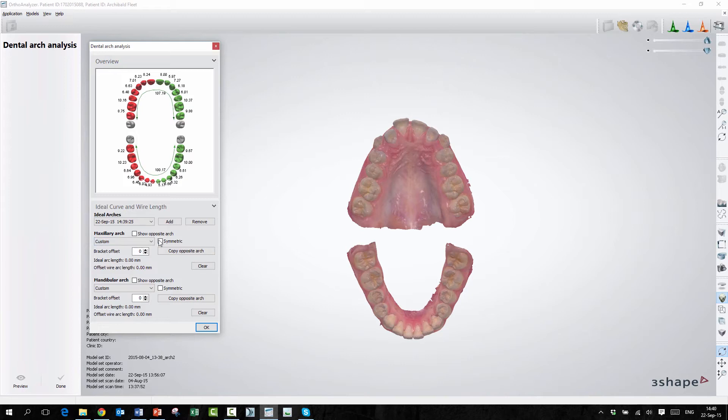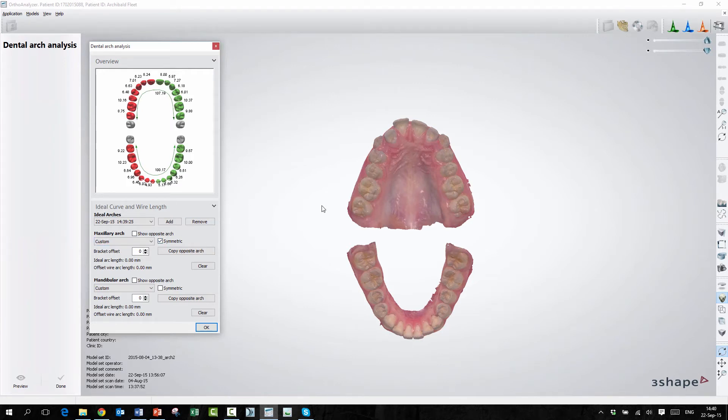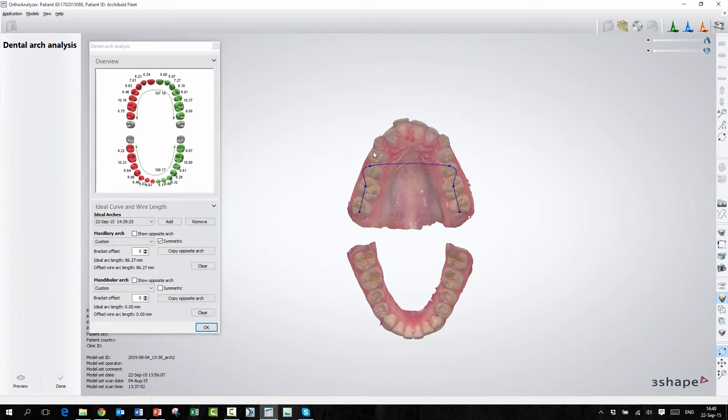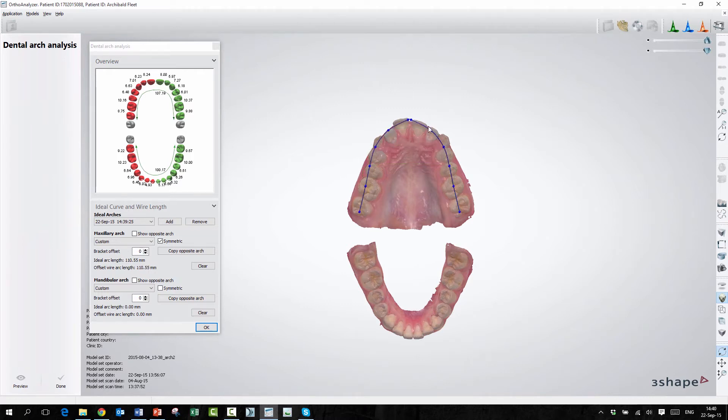So if I press symmetric here and take a custom arch, I will just set some points, and you can see that it will be completely customized, the arch wire that I've created. Based on the plane that you created in another step. Exactly.